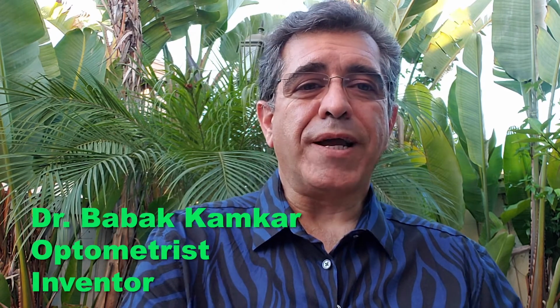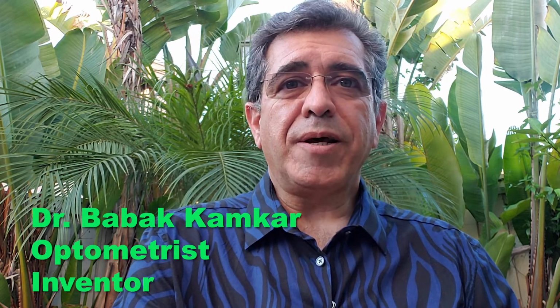My name is Babak Kamkar, and I'm an optometrist in private practice in Southern California. My disclosures include that I'm a consultant to Good-Lite and the inventor of the APD tester.